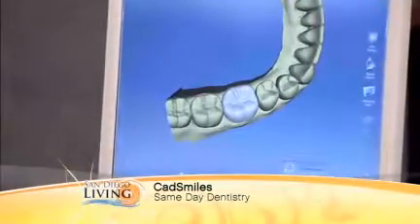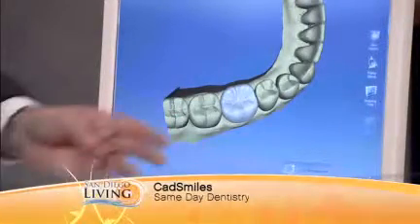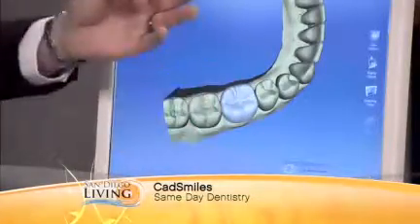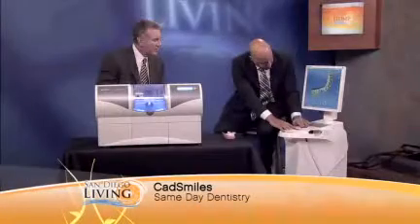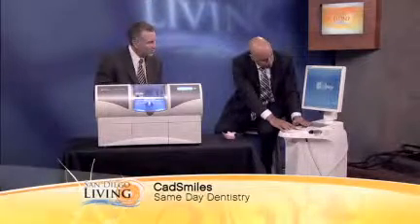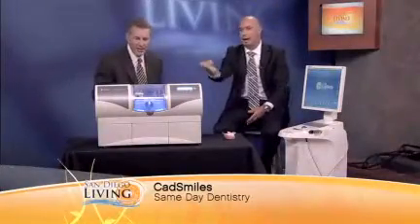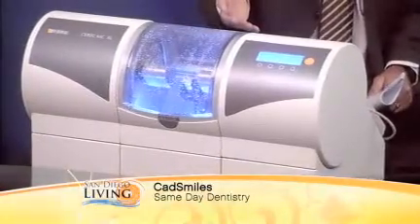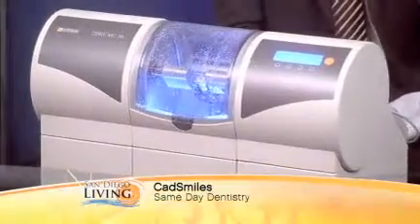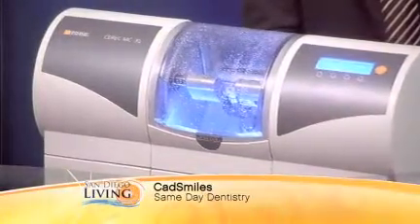This is, for the sake of the show, it's easier to show a crown because I have a finished product here in front of us. So right now it's just calculating where to touch the adjacent teeth and also the opposing dentition. So it just tells you where the tooth is supposed to go. So now here, all we have to do once the tooth is made, we can send the information to the machine, and the machine starts milling. Are you kidding me? From a porcelain block that is in there. And this thing is going to mill that tooth? It's going to mill whatever's in here. You can see a little sample of the block here on the screen. So that is going to be milled in about 10 minutes.